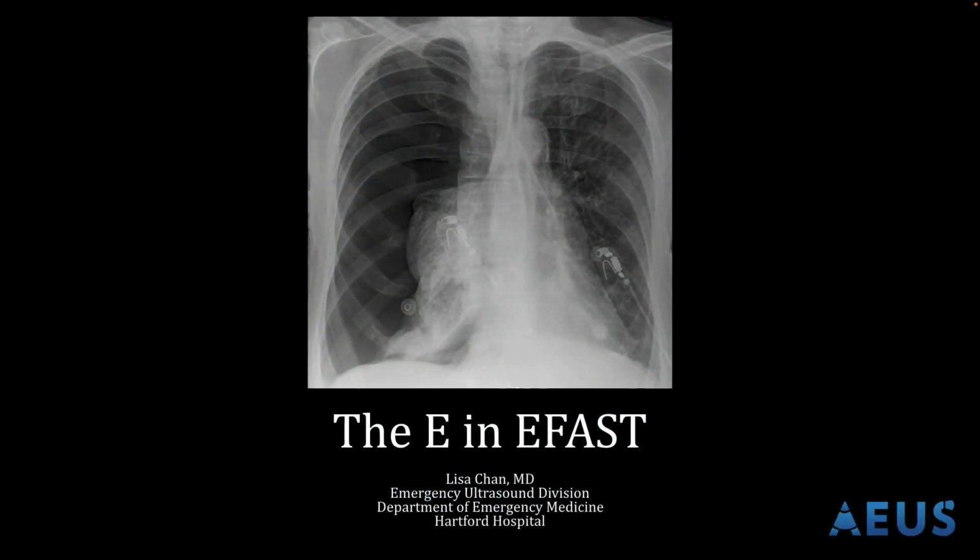My name is Lisa Chan, and today I will be talking about the E in EFAST. Specifically, I'll be covering the evaluation for pneumothorax using point-of-care lung ultrasound.